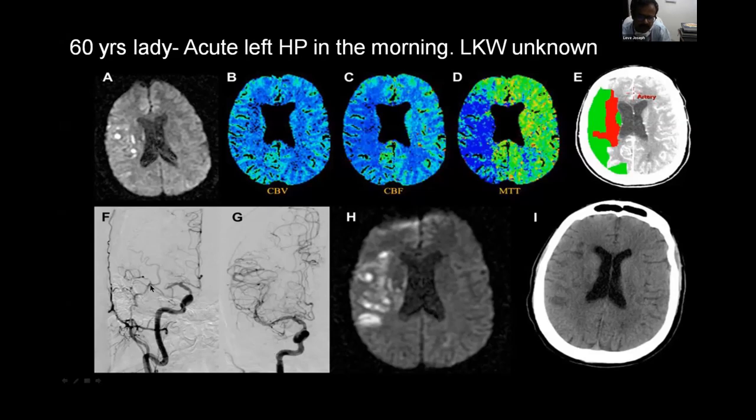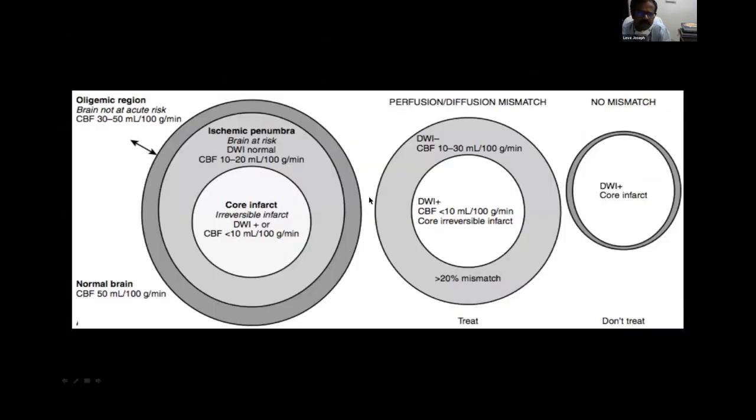This patient was recanalized. The follow-up MR next day shows a slight expansion of the infarct, but given the area at risk, I think we have sizably limited the infarct. Probably this patient was spared a craniectomy also. So this is a basic theory.